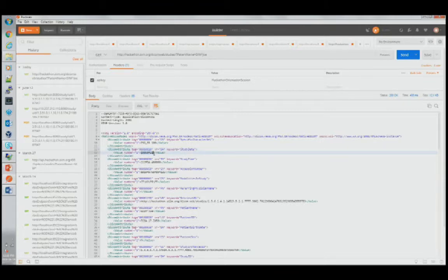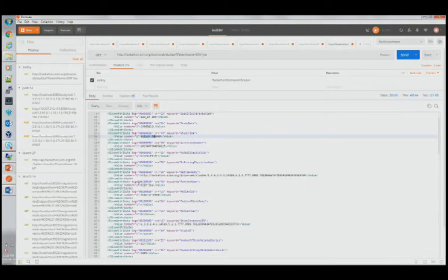That being said, yes, some of these things do look archaic. For example, this is the date format in DICOM. So you see year, month, day. It's a little awkward. Same thing for the time format. You notice it doesn't use any separators. So it takes a little bit of getting used to. It's an acquired taste. Brad didn't start the presentation by saying it was pretty. We never said it was pretty, right?